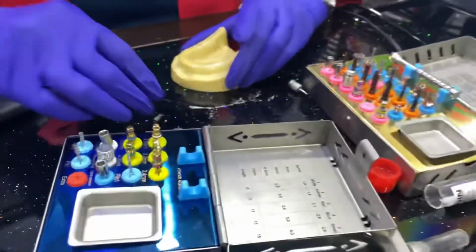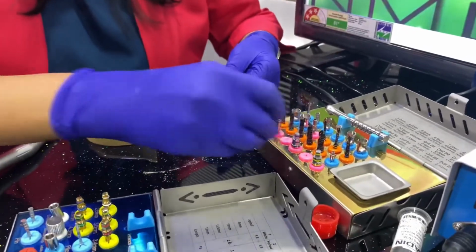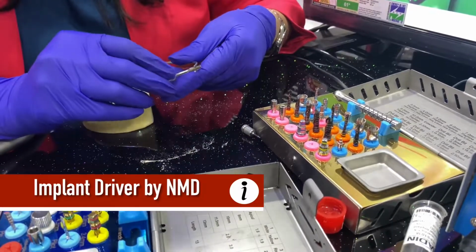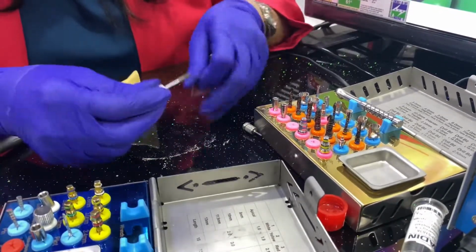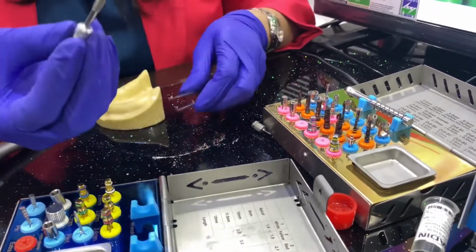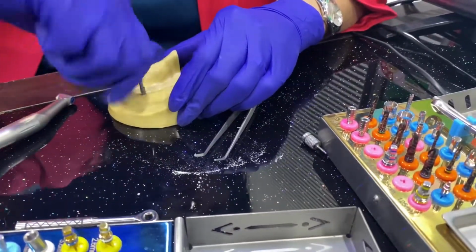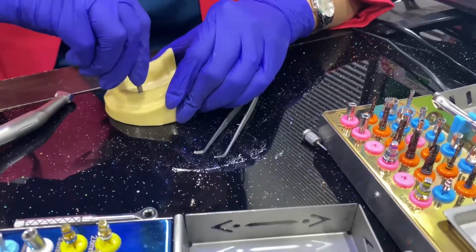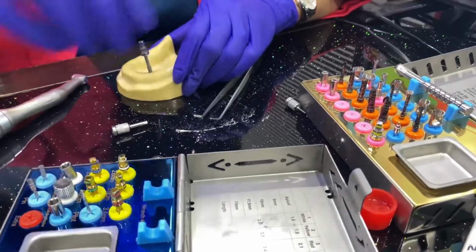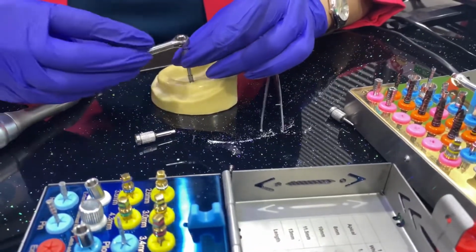And now we will be going ahead and placing our implant. So this is a dummy implant which we will be placing in this. This is an implant driver. You will get this in your implant kit or any of our standard implant kits. And you will not be touching the implant surfaces. This is just because it's a dummy implant. Normally it comes with a mount. So I will place half with hand and then I will torque it.